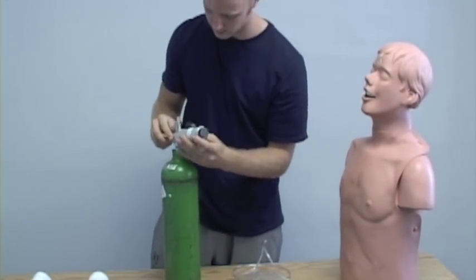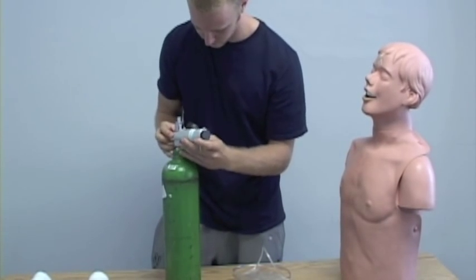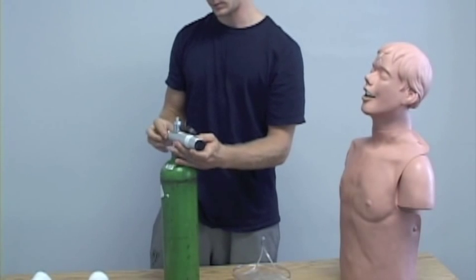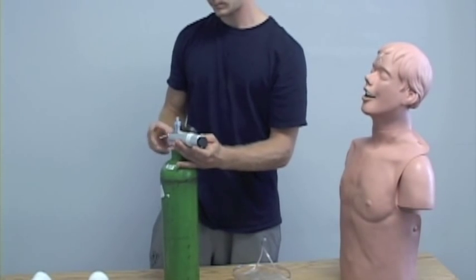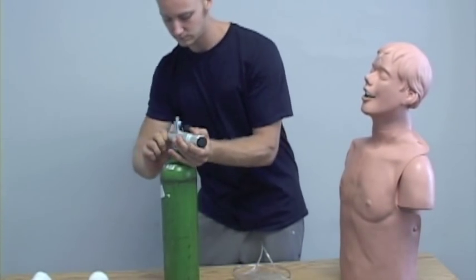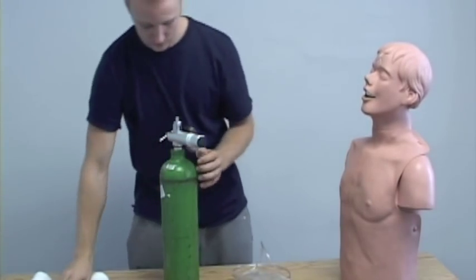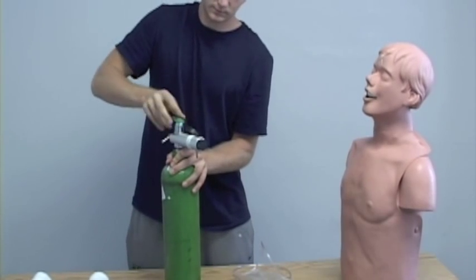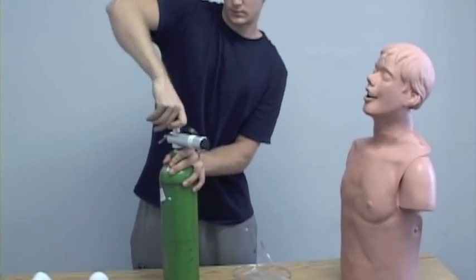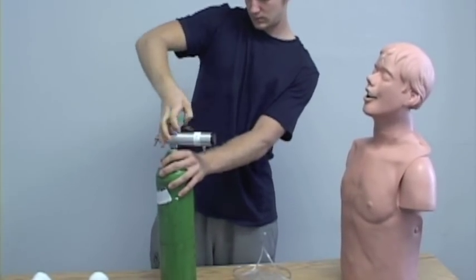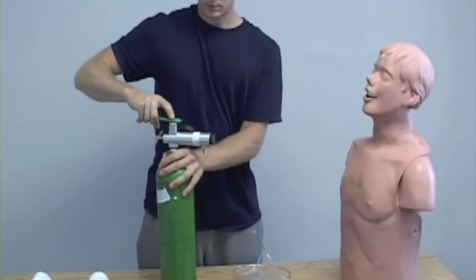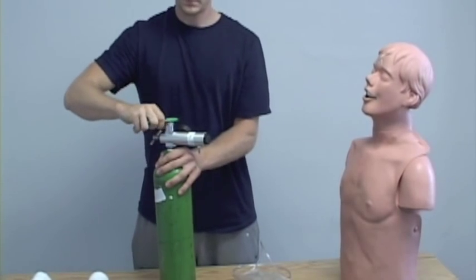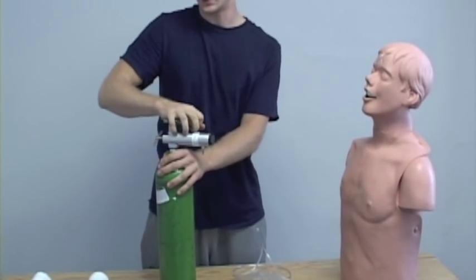Now I'm going to apply. Make sure it's off. Open it all the way to check for any leaks. Check the pressure. Pressure's good. Close it again. Then open it from a half to full turn.